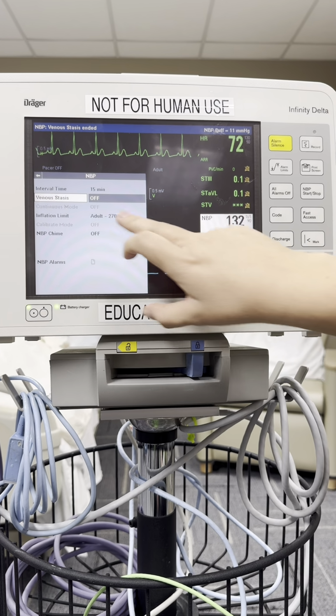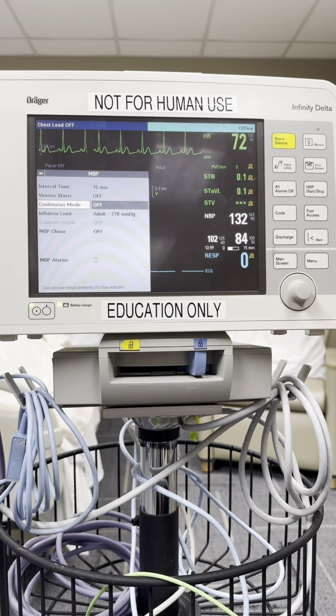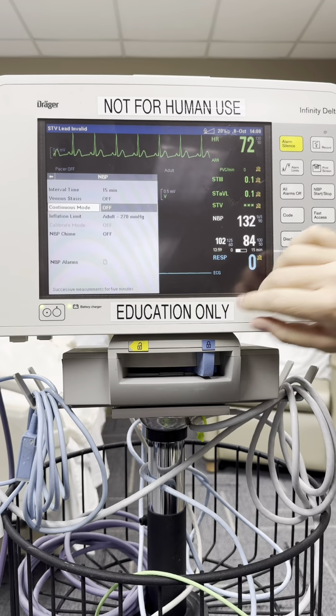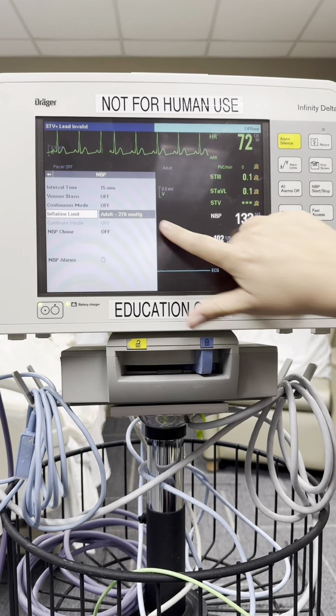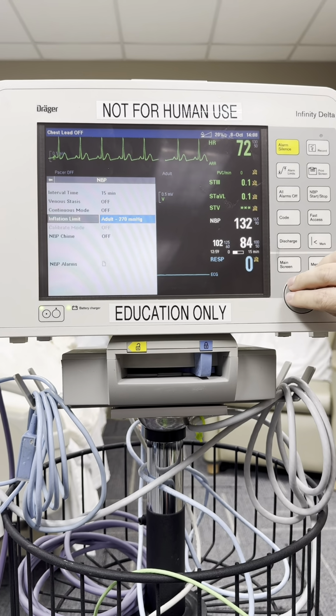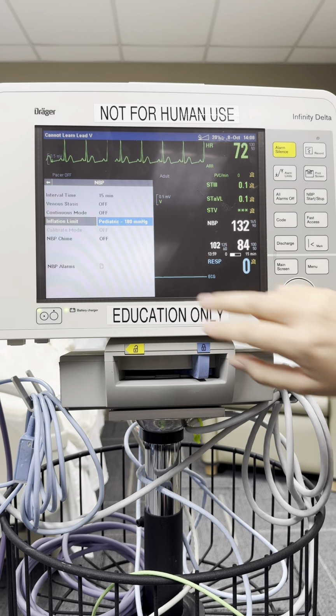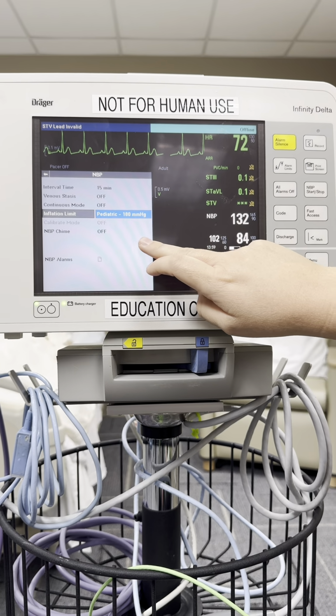The continuous mode will continuously take blood pressures. As soon as one's done, it'll take another one. The inflation limit, as you can see, ours is set to adult. You can change it to pediatric. That's not recommended. That just changes how high the blood pressure cuff will blow up to.